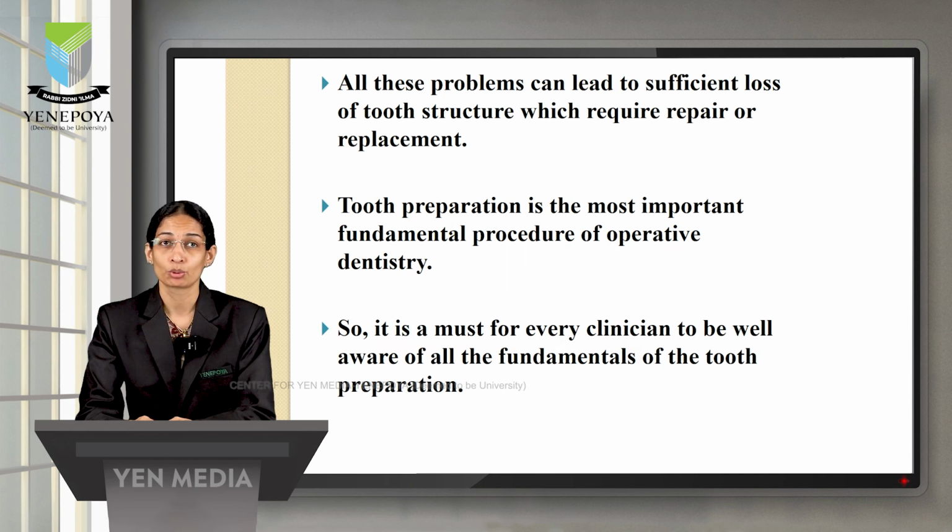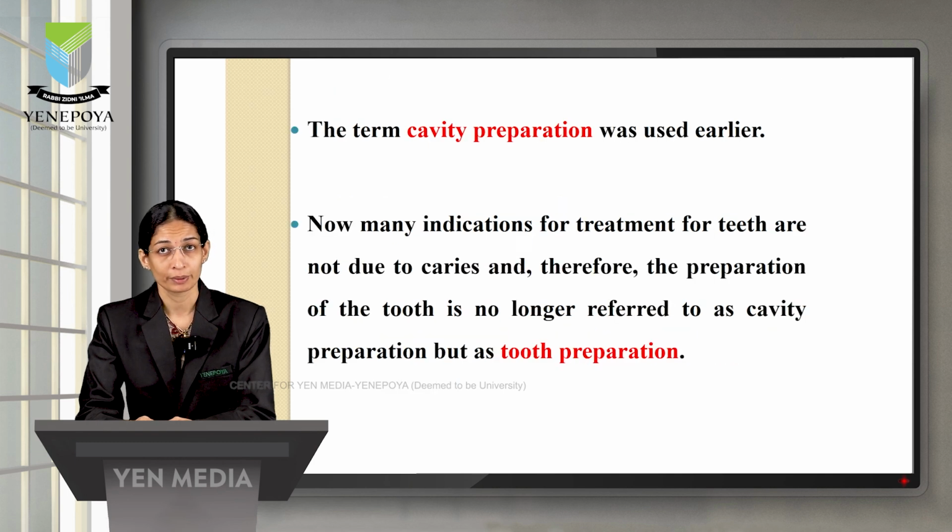Tooth preparation is the most important fundamental procedure of operative dentistry. So it is very important for every clinician to be well aware of all the fundamentals of tooth preparation. The term cavity preparation was used earlier, but now many indications for the treatment of teeth are not due to caries, and therefore the preparation of the tooth is no longer referred to as cavity preparation but as tooth preparation.